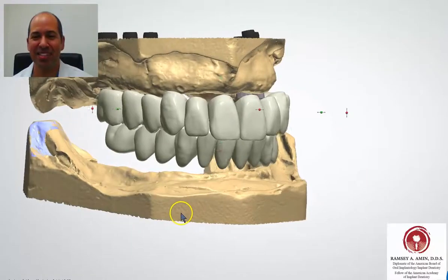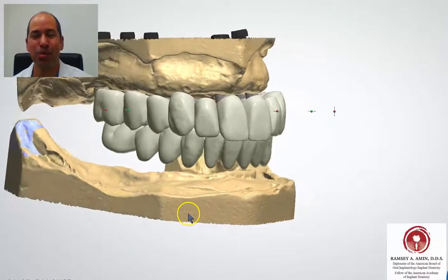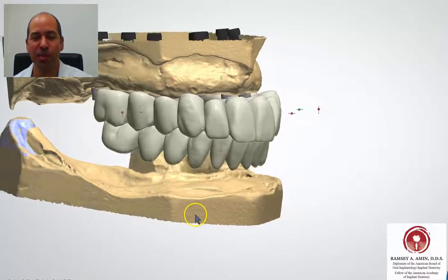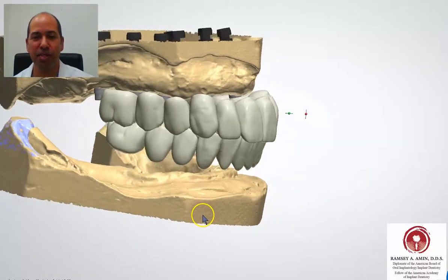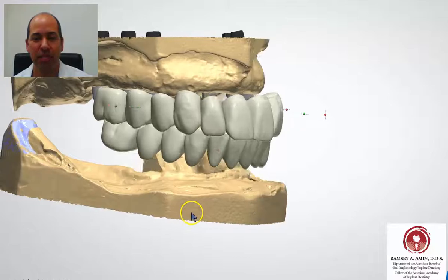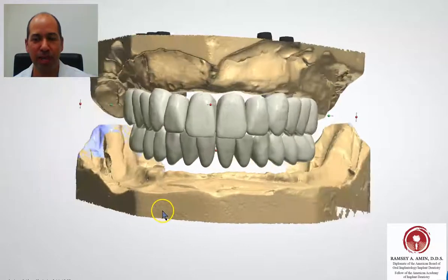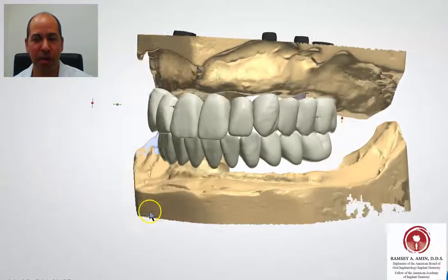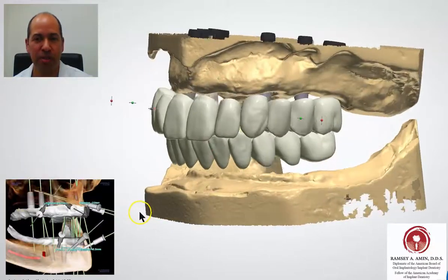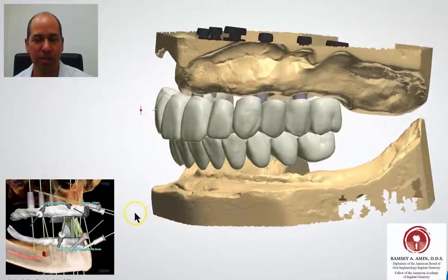Ramsey Amin DDS here. This is some cool stuff. What you're seeing here is 3D imaging and 3D fabrication of upper and lower dental implant bridges.